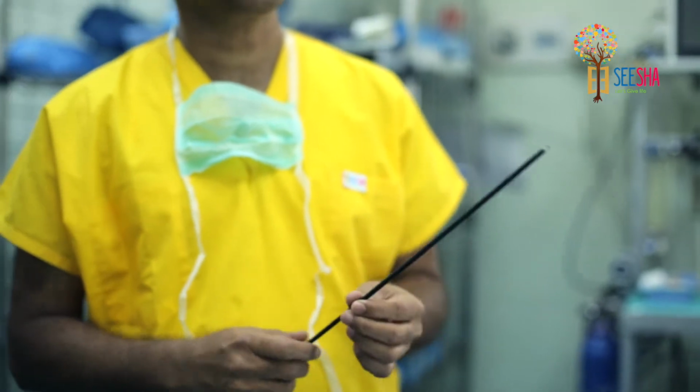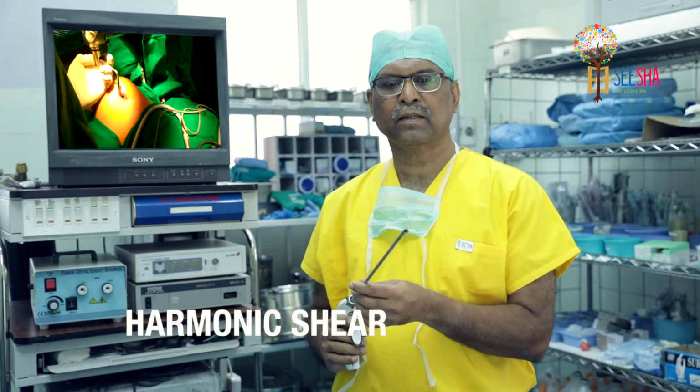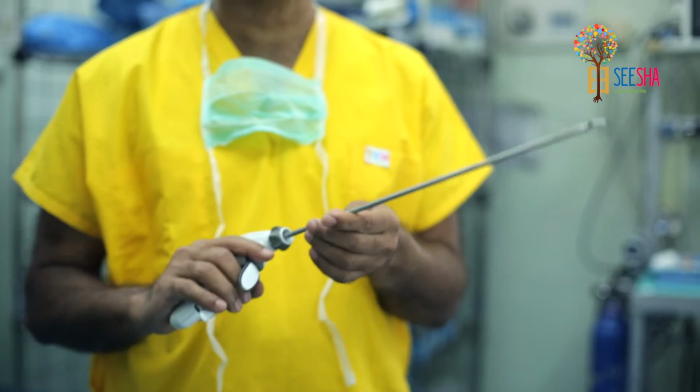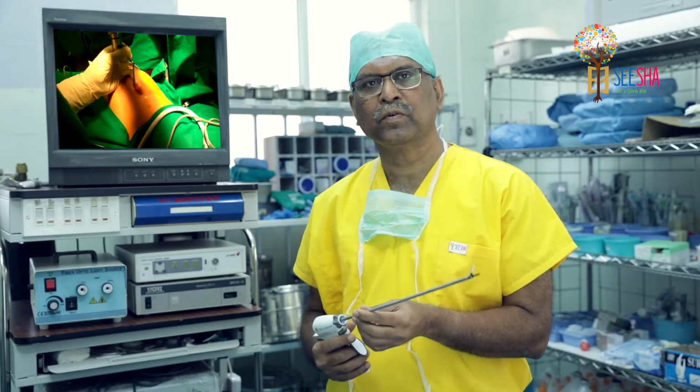This is a hook which can be used for releasing adhesions. And if necessary, we can use either the vessel sealing equipment or the harmonic equipment to release adhesions, which are fairly common and contribute to infertility.